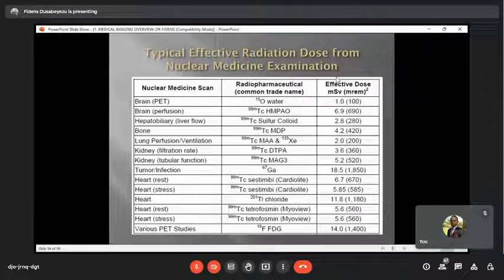Every personnel in radiology should know it and have it. Even a clinician should know that when I send a patient to CT scan, I should know how much I am going to expose this patient to radiation. Have just an idea, just an estimation. Okay.